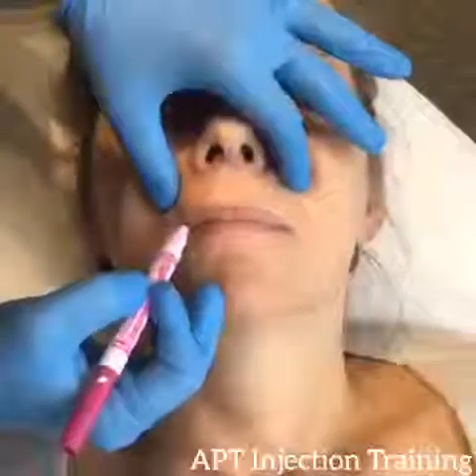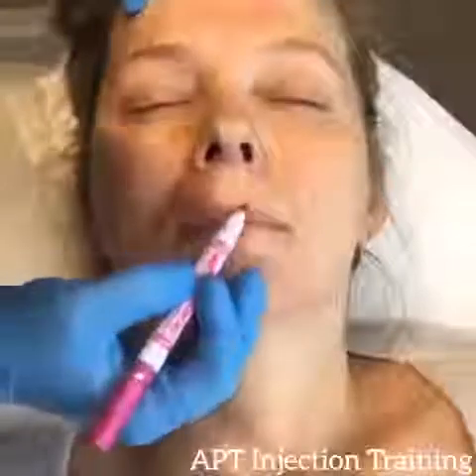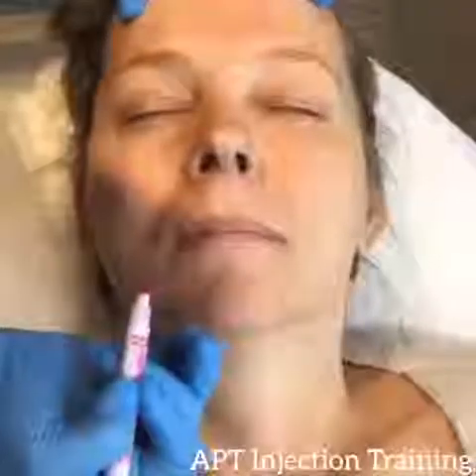The issue with the tunnel is you can't find it very easily. When you are in it, you'll know you're in it because as you inject product, it just whips up to the Cupid's bow and it glides very quickly and very easily. It's kind of cool to see, but you just can't reliably find it.